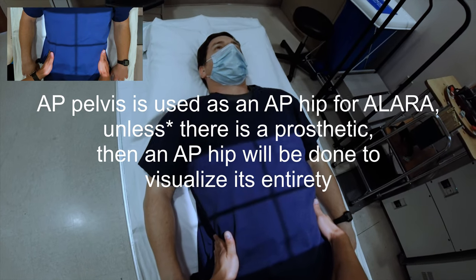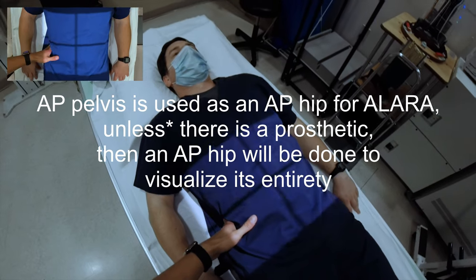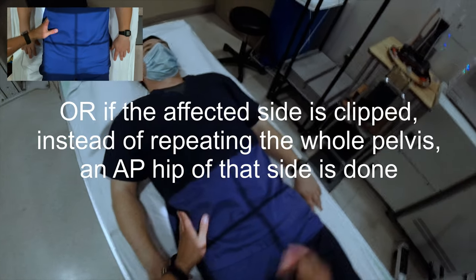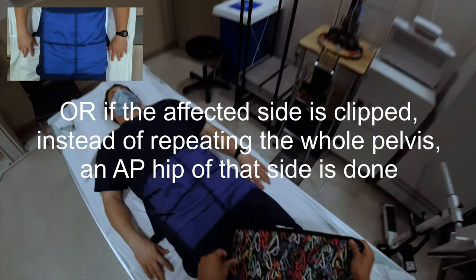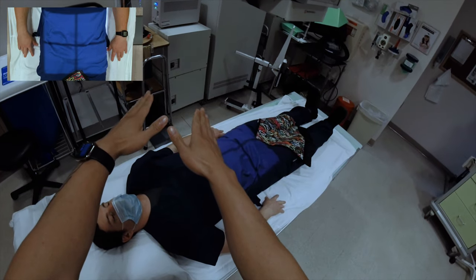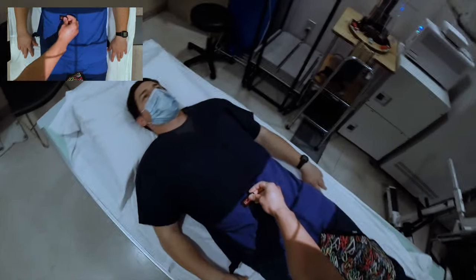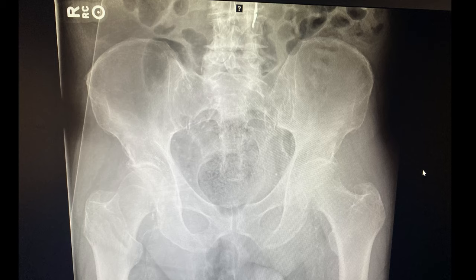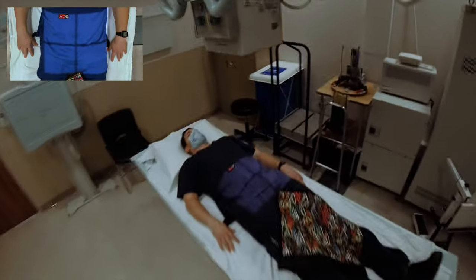Take a breath in, blow it out. Breathe normal. So you're going to roll your toes together so they touch. There you go. And hold still. All right, you can relax your toes.